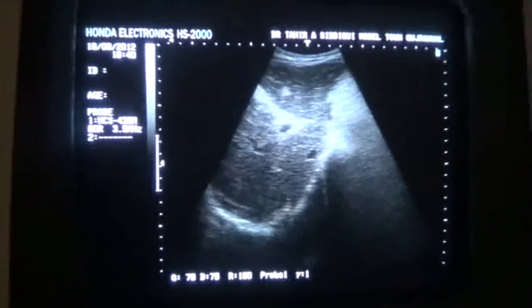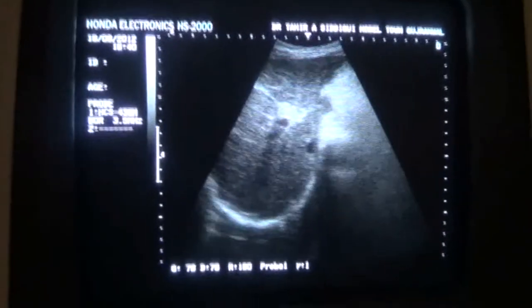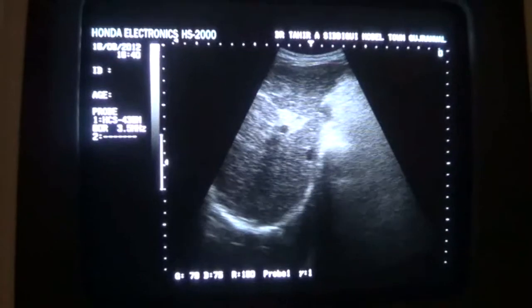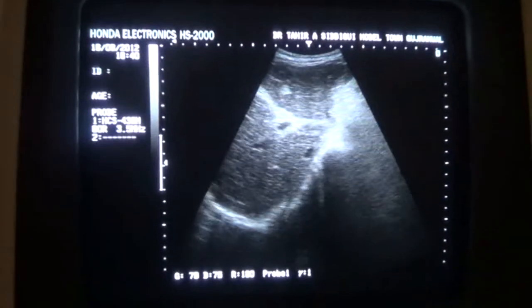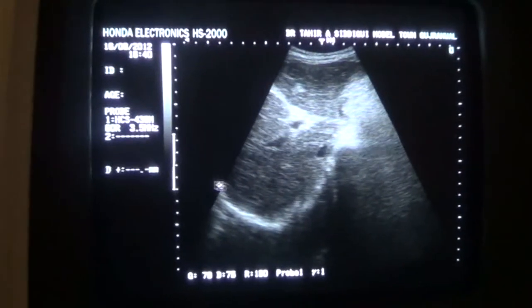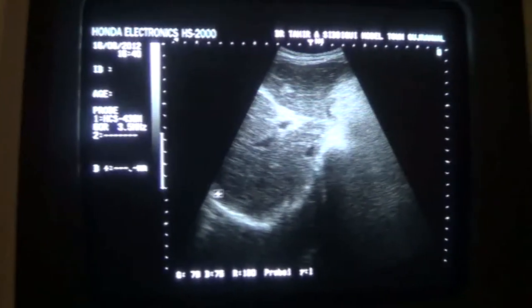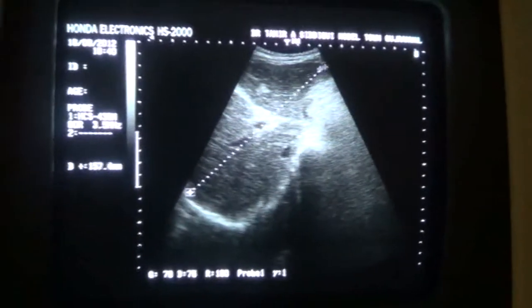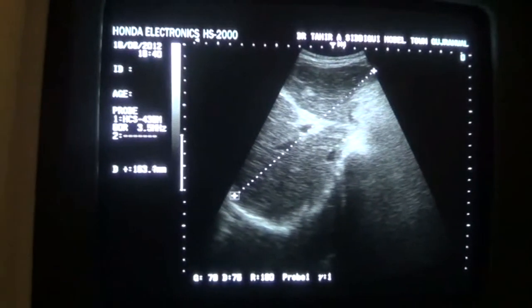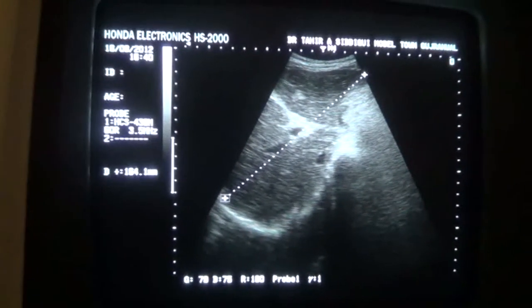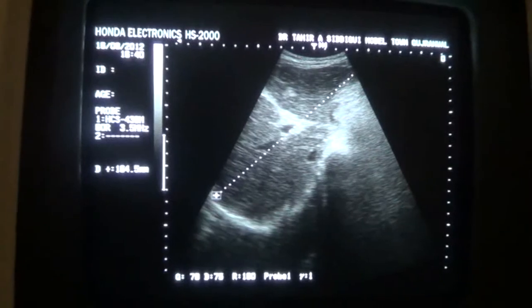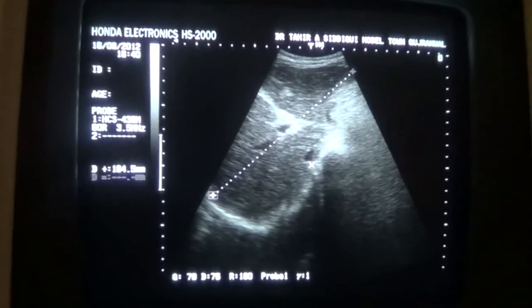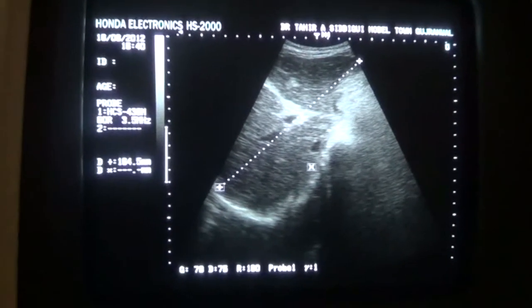This is the liver — a cirrhotic liver. From here, this is the right diaphragm, and up to this level, this is the liver.